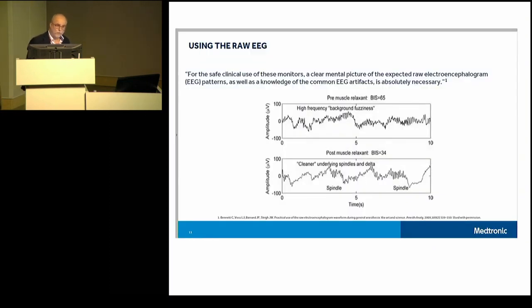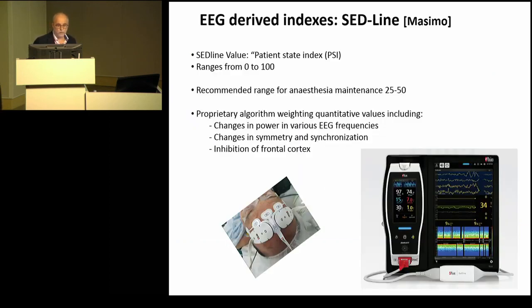That is so important that even the manufacturer tells you that for the safe clinical use of these monitors, a clear mental picture of the expected raw electroencephalogram patterns, as well as the knowledge of the common EEG artifacts, is absolutely necessary. It is not me saying it, it is the same producers of the machine. So it is important that you are able to analyze and read what the EEG is showing you.